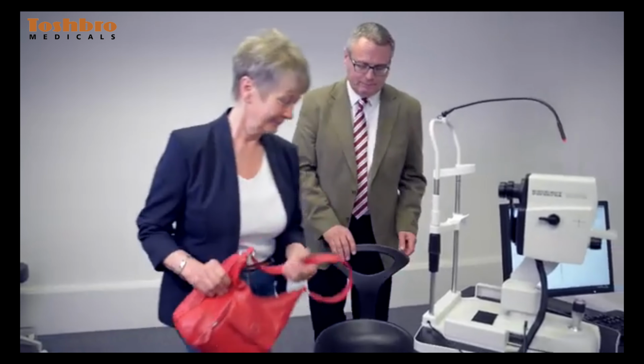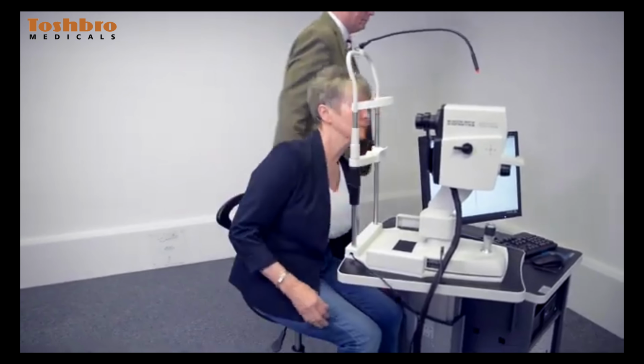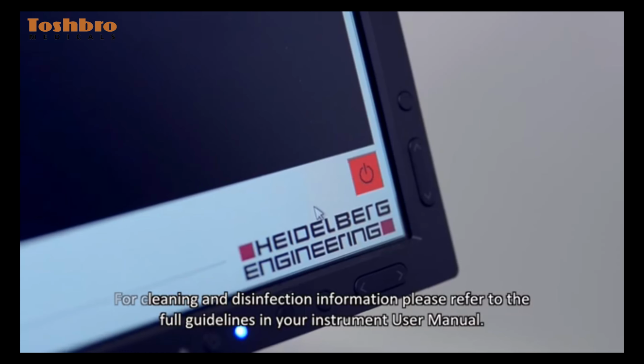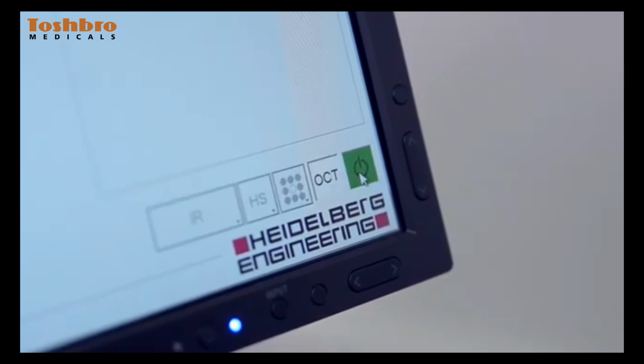After welcoming, the patient should be seated at the Spectralis instrument and the headrest cleaned in accordance with local infection control policy. Patient details should be entered into the HEYEX software and the image acquisition module started.